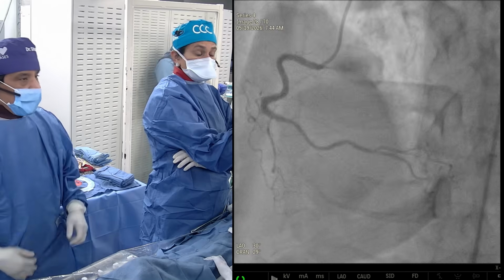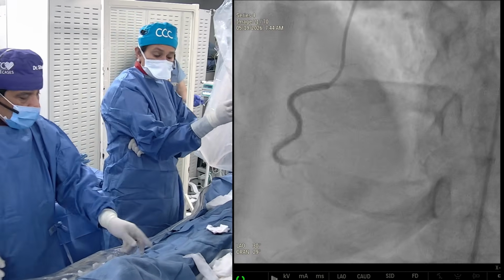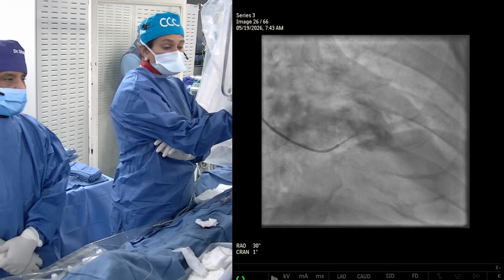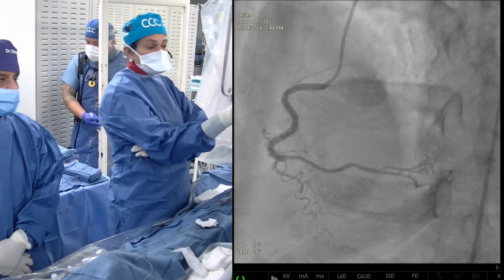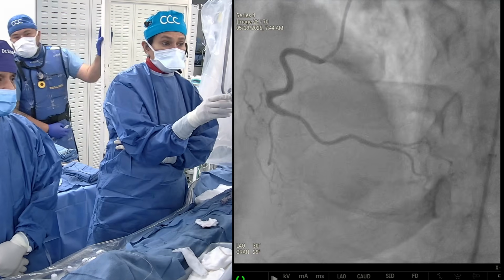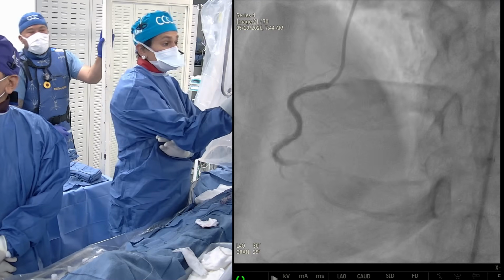So this is a similar experience we are going to go through, with educational points. You see on the right corner, the EDP was normal, EF is normal, and the right coronary artery had a significant lesion which has been taken care of. And you can see the tram track calcium on the left side right now. Look at the calcium.